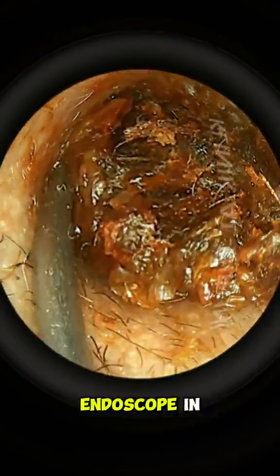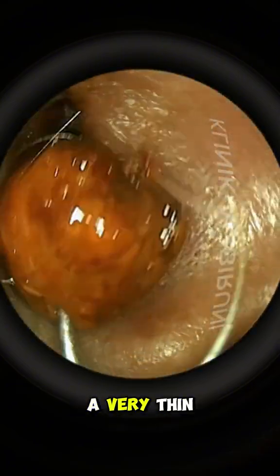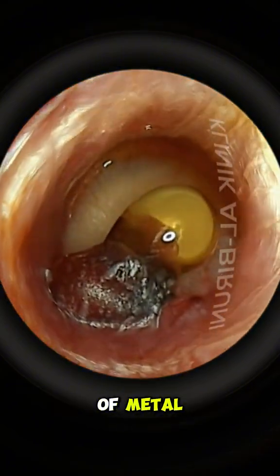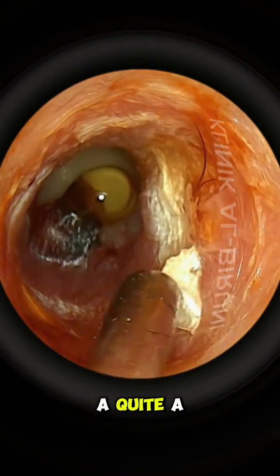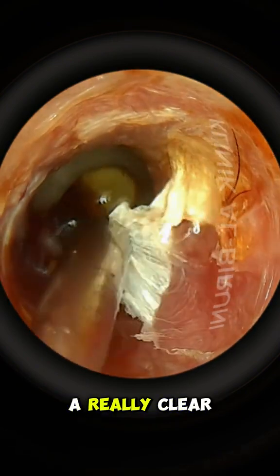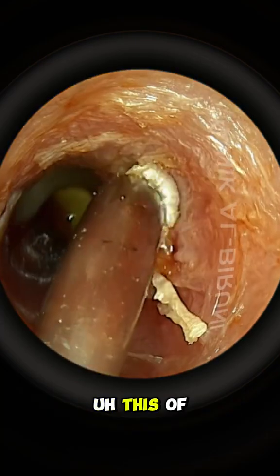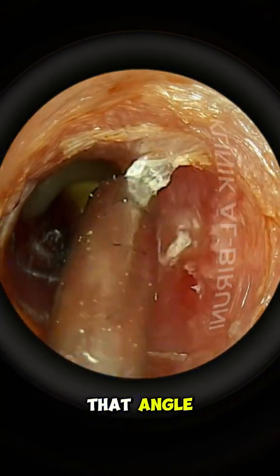And when we're putting the endoscope in, it's a rod endoscope. So you imagine a very thin but straight piece of metal that we have to get in there. Now, if you've got to negotiate those bends, if you've got quite a severe one, it's a lot harder to negotiate and sometimes get a really clear view without pushing the entrance to the ear canal open a little bit to be able to get that angle to see the view.